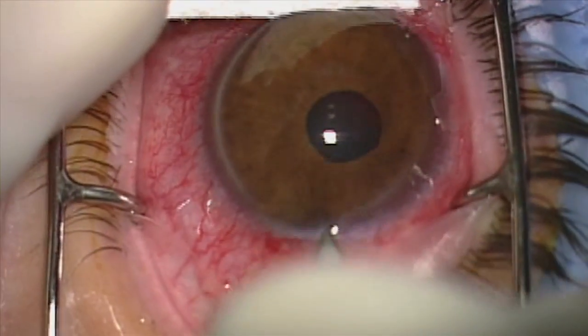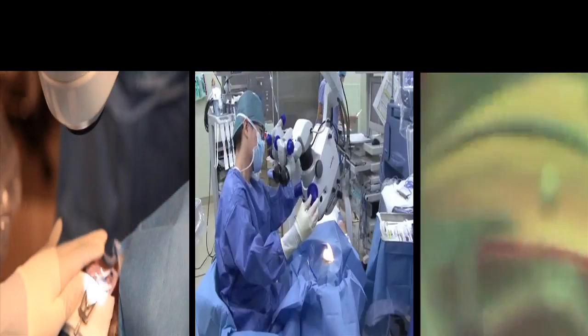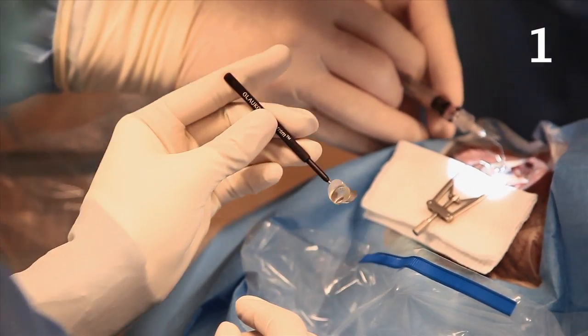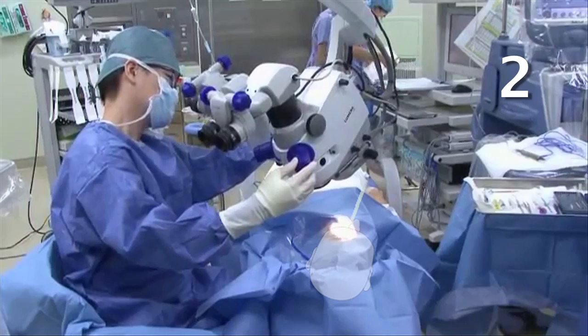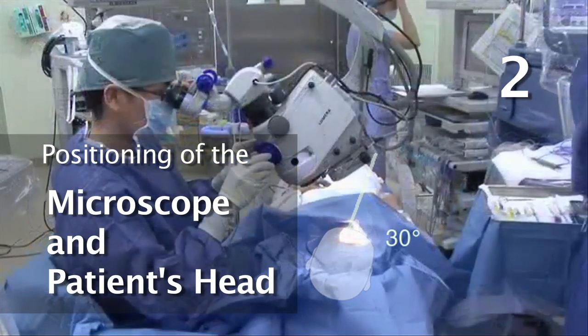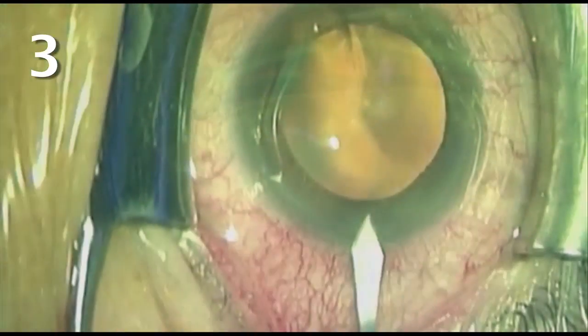While the concept is simple, there is a learning curve. In this brief presentation, we'll focus on three basic fundamentals: the proper use and the importance of practice with the goniolens, the position of both the microscope and the patient's head in relationship to the surgeon, and the accurate identification of the trabecular meshwork through a simple technique of burping the clear cornea incision.